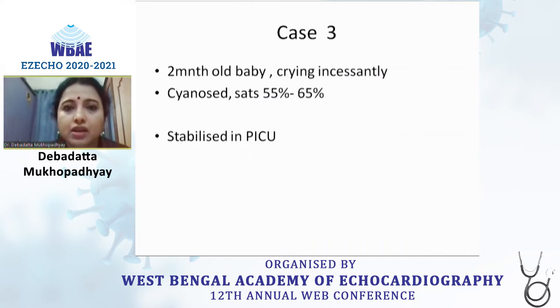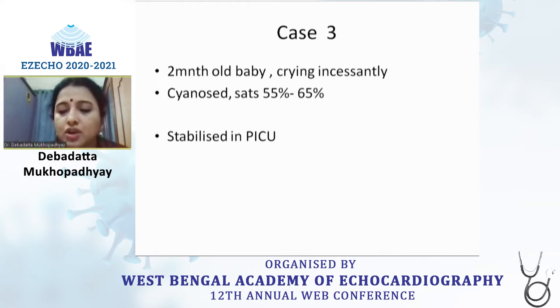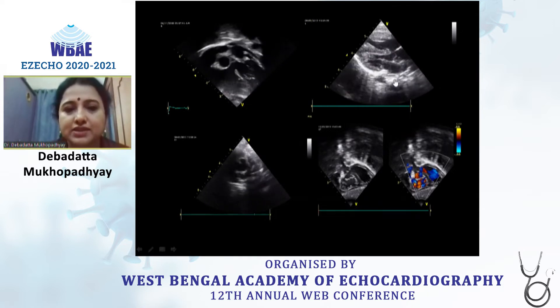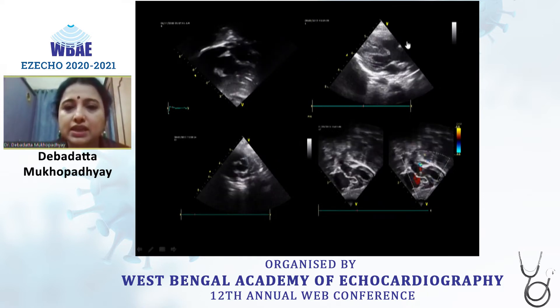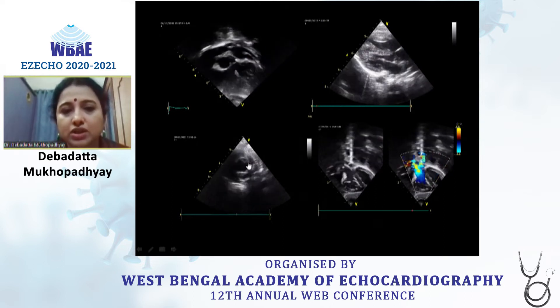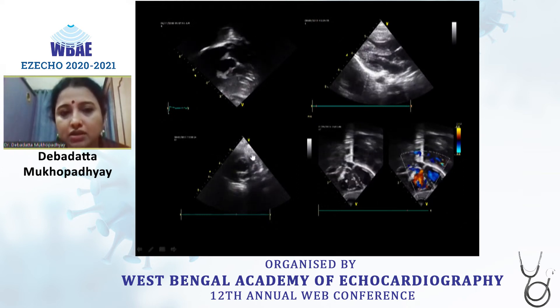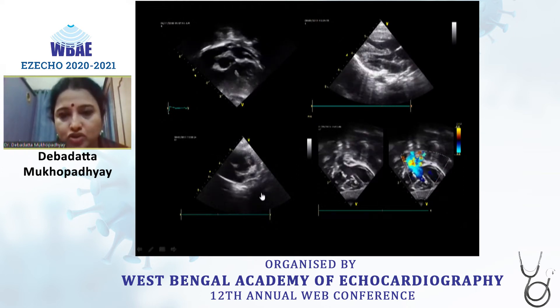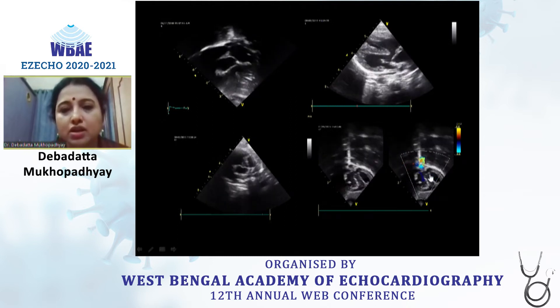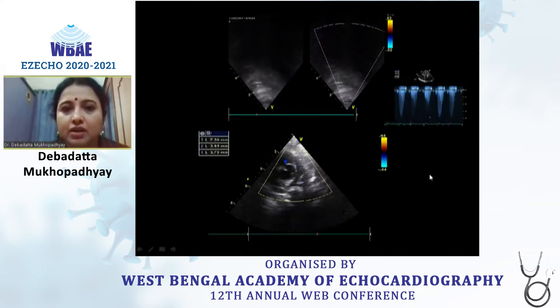Our third case is a cyanotic infant who came with incessant crying and desaturations and was stabilized in the PICU — a pretty usual case of tetralogy presenting with spells. We can see the large VSD with overriding of the aorta and also the outflow tract malalignment causing pulmonary obstruction. The subcostal sweep confirmed no extra VSDs.